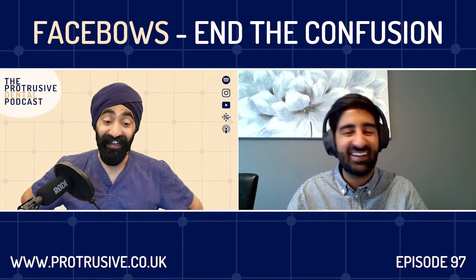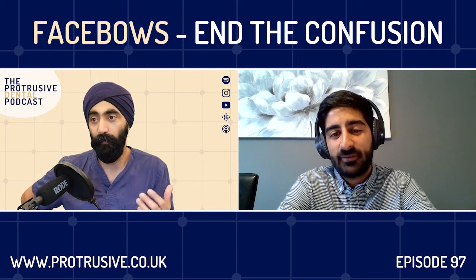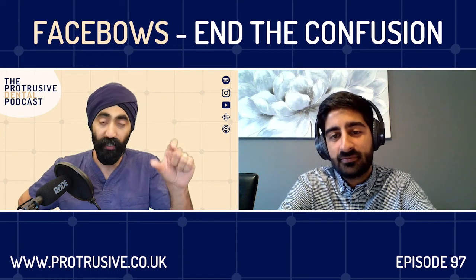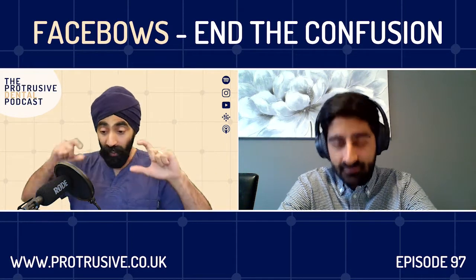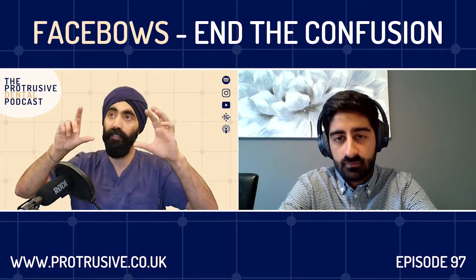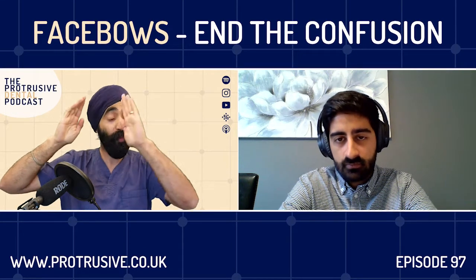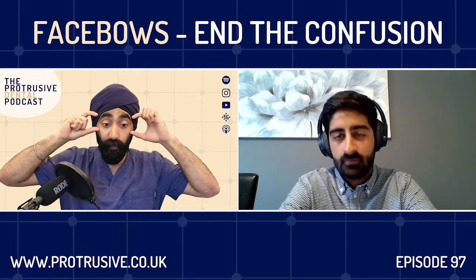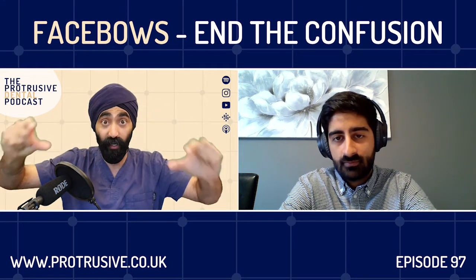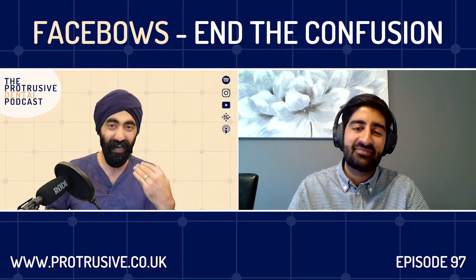But maybe I was always thinking about how to implement that, because I know some colleagues who actually use a fluid level, a spirit level on their Facebow to make sure they truly are. Or this is really clever. Lucas Schlasman taught me once that with some patient sunglasses that they put on before they take the portrait photograph, they put the sunglasses on the patient just to make sure the fluid bubble is correct. Then they take the glasses off and then they take the photo. That's a really high level detail, but you're right.